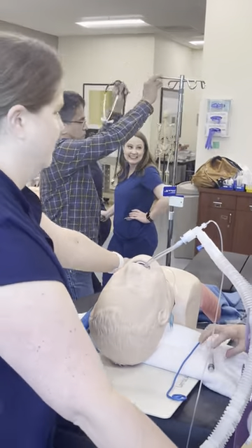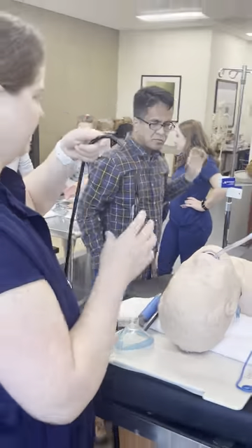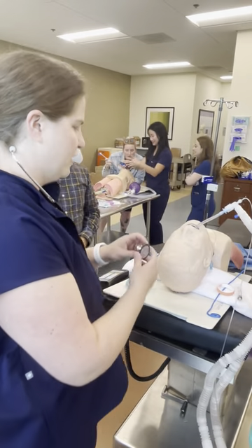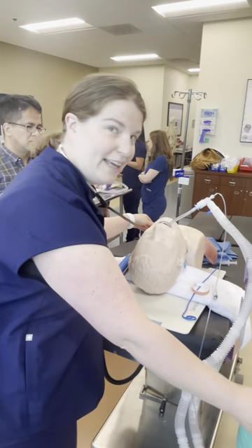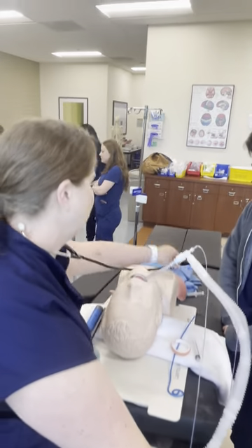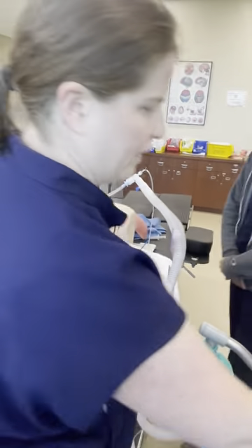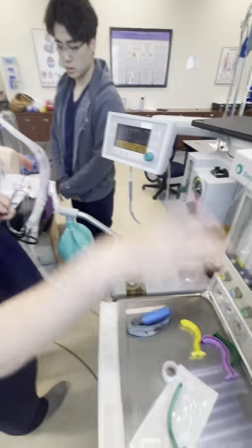You're actually going to auscultate over the stomach first — negative epigastric. Then where do you listen? The stomach, and then both lungs. I start with the left lung because you're more likely to main-stem the right lung, so if you have lung sounds on the left you can be pretty sure you're in the correct position. Positive, positive, then negative epigastric. From there, turn your vent on, do a sweep — we'll go over that.